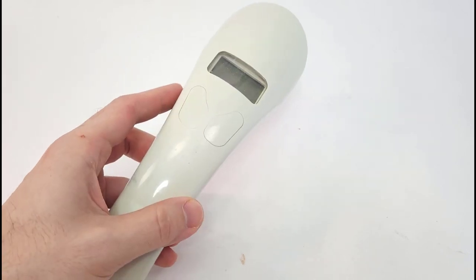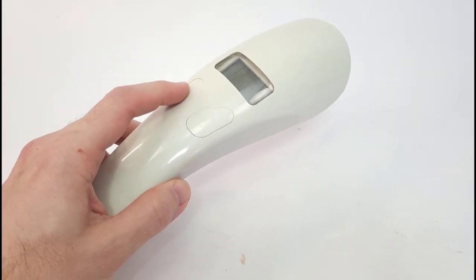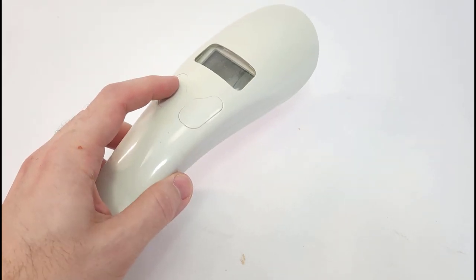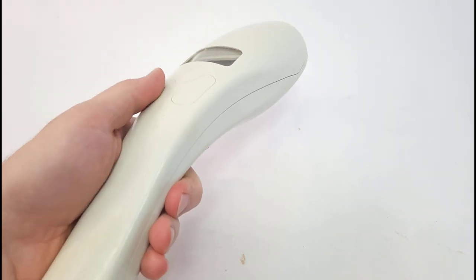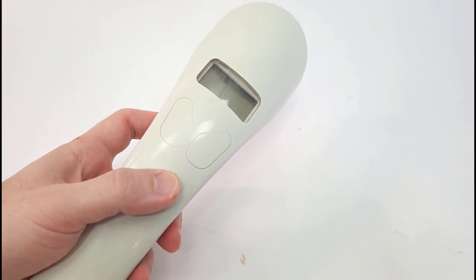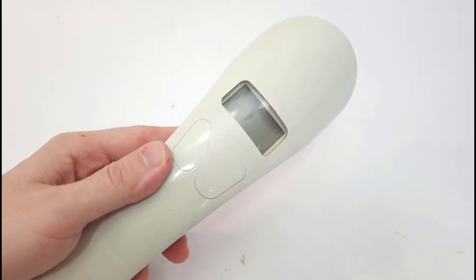My wife is a veterinarian at an animal shelter, and I have now repaired two of these microchip scanners that stopped working, and it turned out they had the same issue, so I figured I would make a video about it. This is a tool that, if the animal has a microchip under its skin, you use to scan it, and that gives you a unique ID number so you can look up the owner's contact information to contact them if the animal came in as a stray.